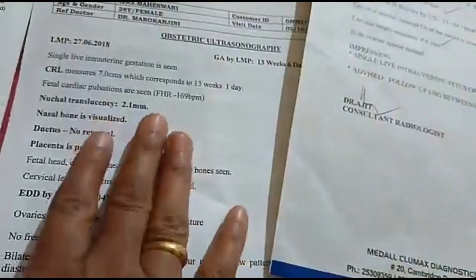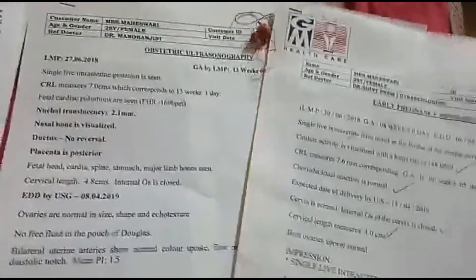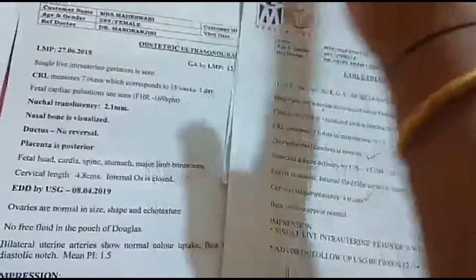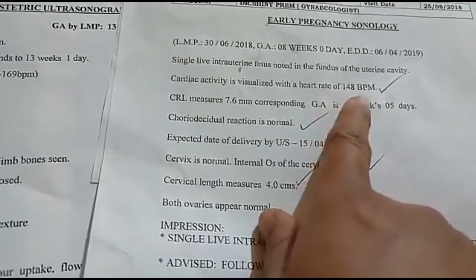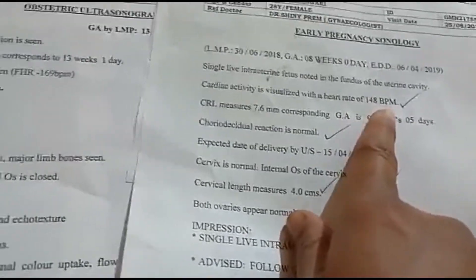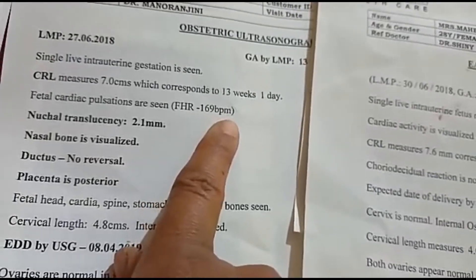I will see my computer data from here. These are the heart rate fluctuations. The first scanning report is 148 BPM. The second scanning report is 169 BPM.